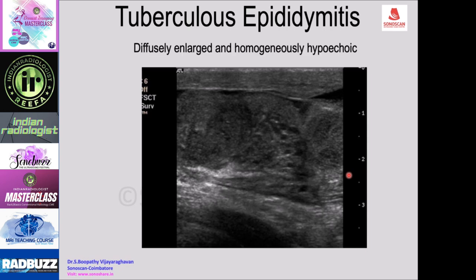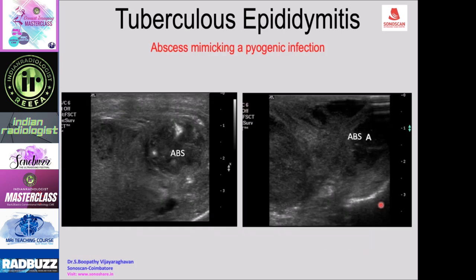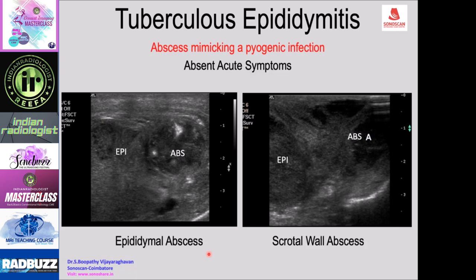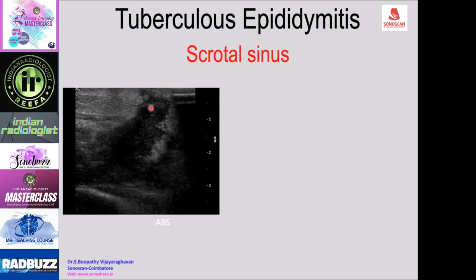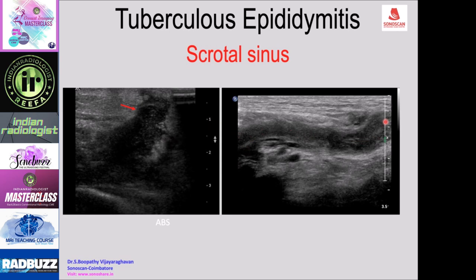The entire epididymis may be enlarged and homogeneously hypoechoic. An abscess may be seen in the tail of the epididymis with a central necrotic area. There may also be a scrotal wall abscess with an enlarged tail of the epididymis. These findings mimic pyogenic infection but the patient may not have acute symptoms. The abscess in the tail can rupture and appear as a scrotal wall abscess, which can then rupture through the skin forming a sinus tract.